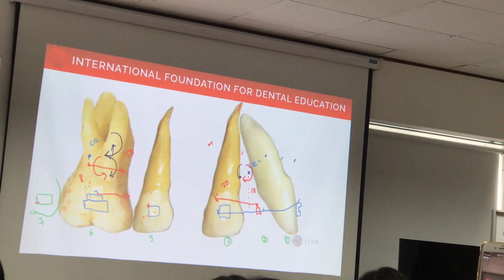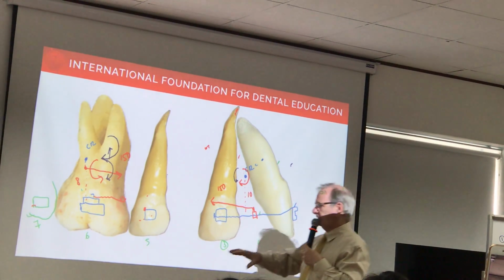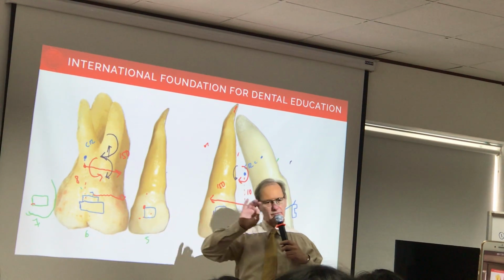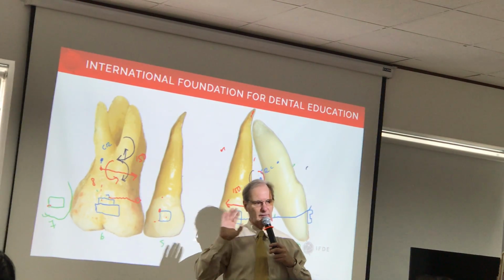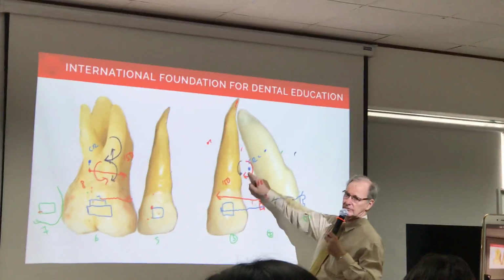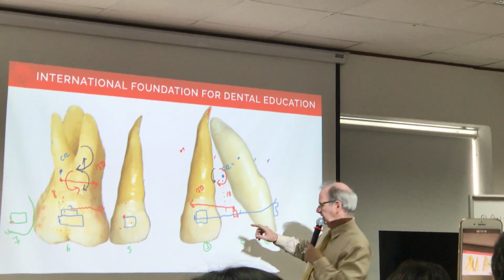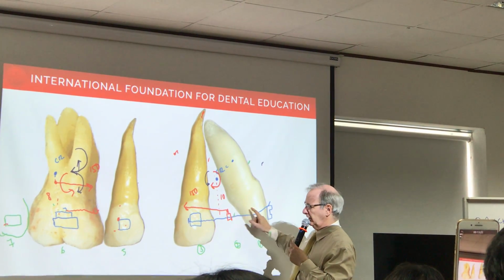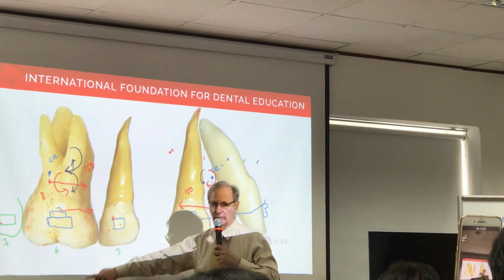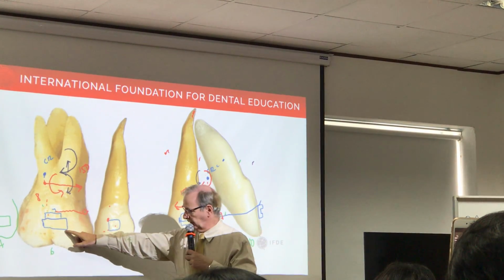Okay. So when you put the wires, always think of what's happening. If I put a very light wire, it looks pretty cool because light force, and I put a small force because I'm such a cool little guy. I'm putting a small force here, but it's still a distance, right? So I'm putting a 16x22 or 16 steel, and I'm starting to put this force, okay? First of all, the wire will tend to bend even more, so I'm going to put even more curve, and then what's going to happen is everything is going to fall in the hole and do that.